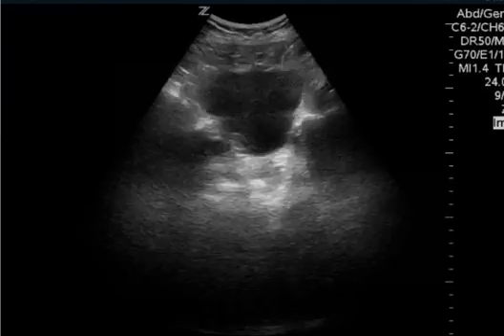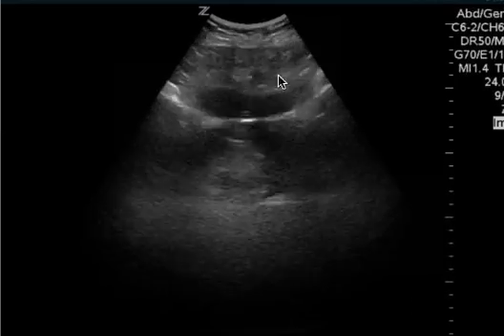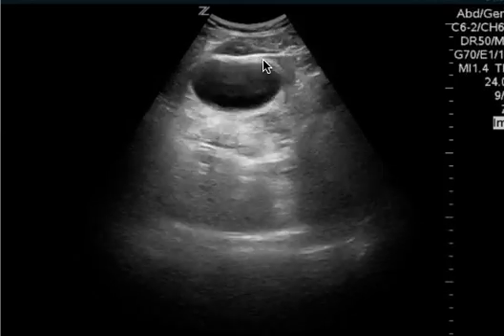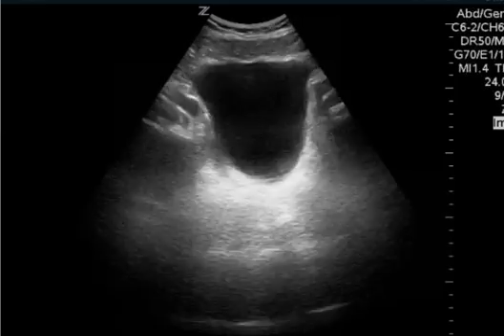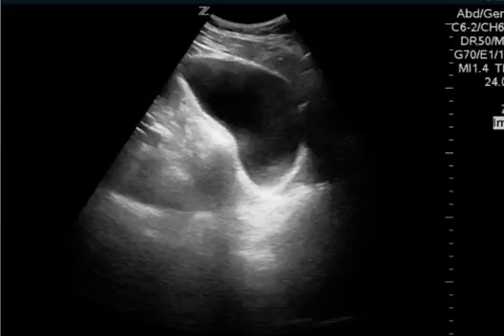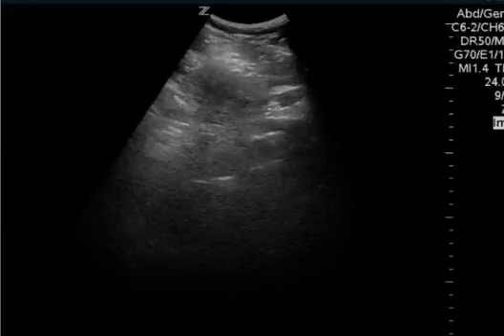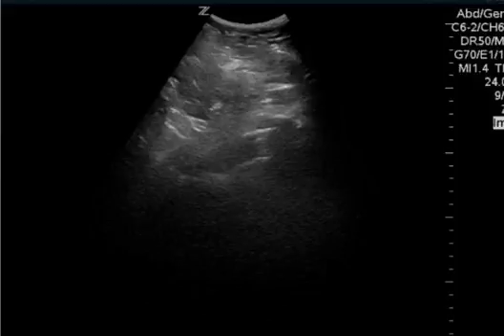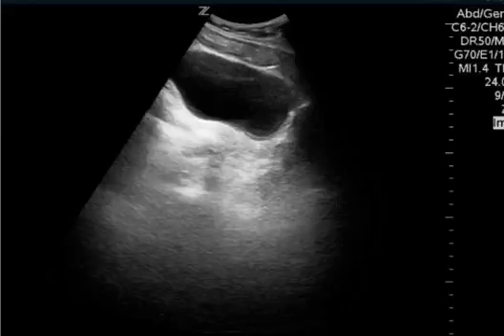This is a different patient, but I hope it illustrates how we like to see the bladder view. You can see this provider take one end of the bladder, fan through or move the probe until it disappears again. After that, they then turn the probe 90 degrees, and they fan through or move the probe from left to right to get the whole 3D structure. And again, I apologize for the quality of the clip here. It is a connection to QPath.